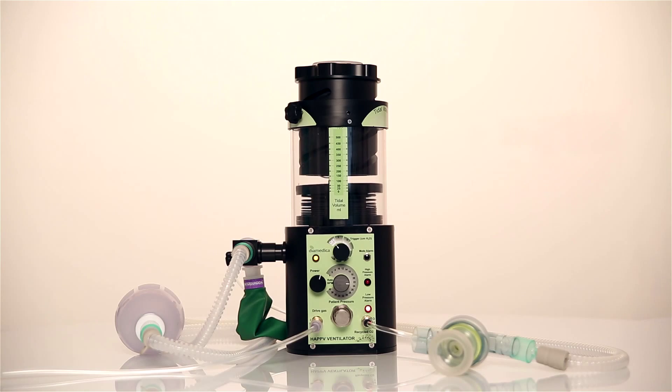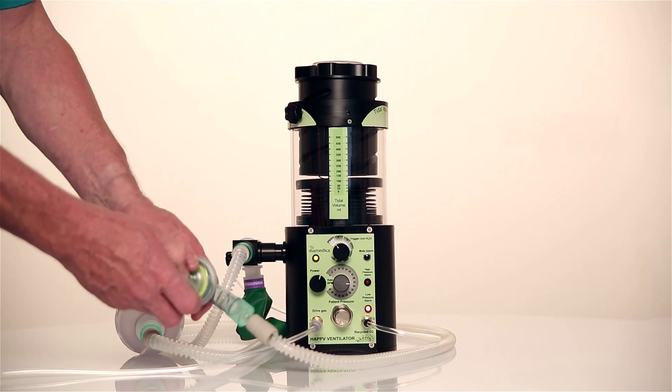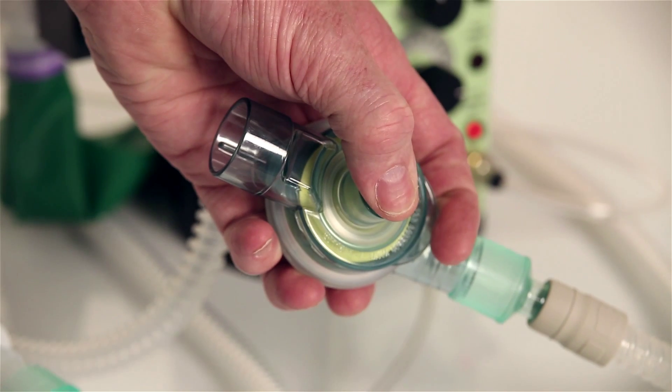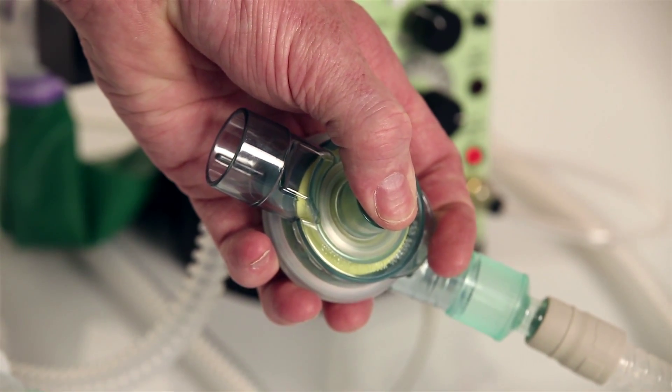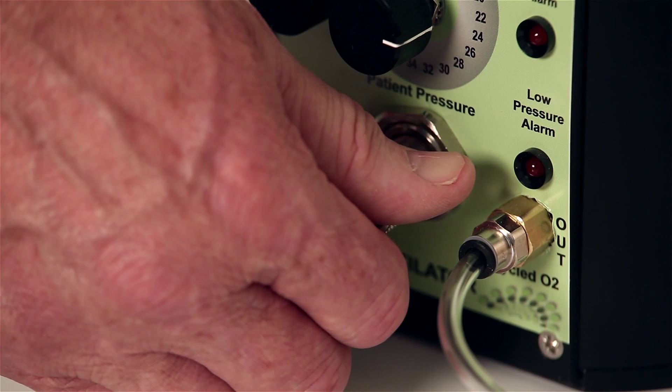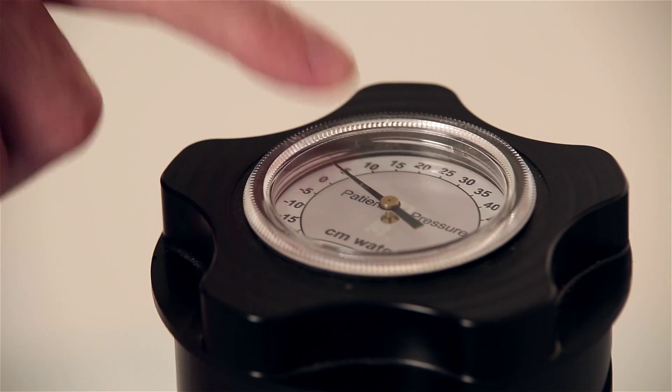To set the initial patient pressure, run the ventilator while occluding the patient valve outlet. Adjust the pressure control until the desired pressure on the gauge is shown.